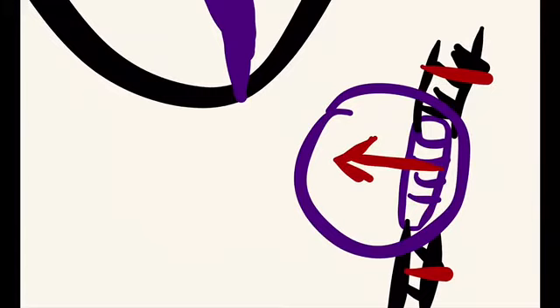Because of this there is no window, and the vector because of the dead tissue and the vector because of the normal tissue will cancel each other. So there will be no ST segment elevation seen here.